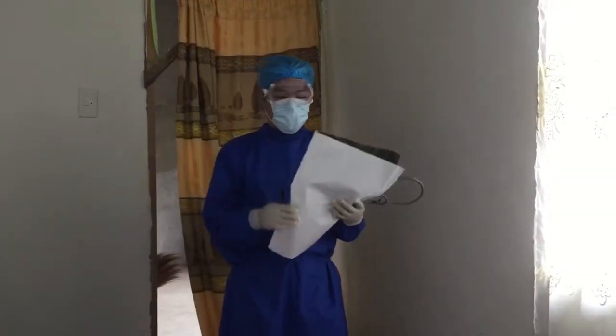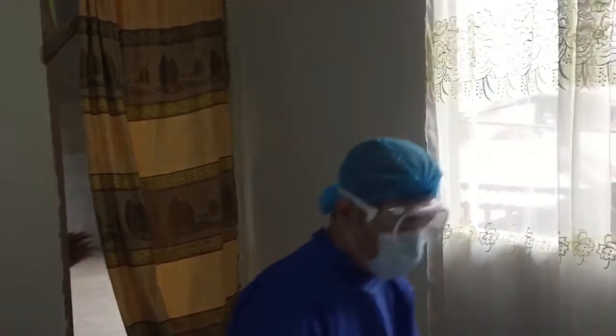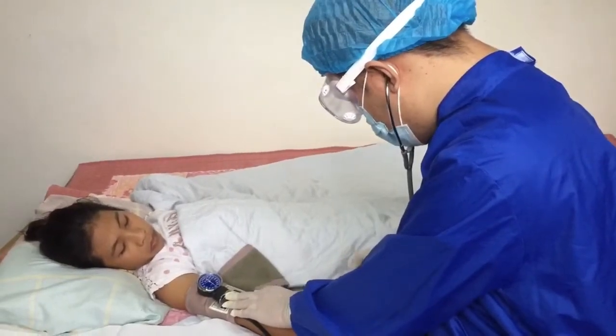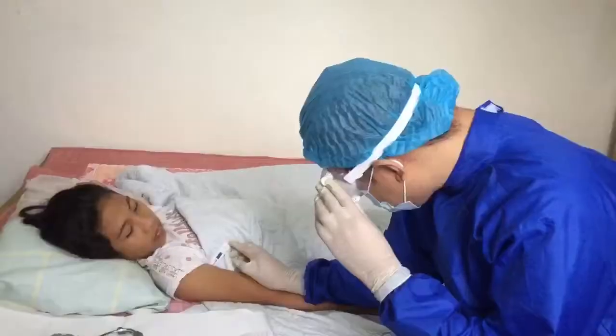Enter the client's room with the necessary equipment. Place paper over the table and put on the equipment. Take vital signs. Follow the procedure in taking TPR. Record the data with the use of the pen and a piece of paper provided for.